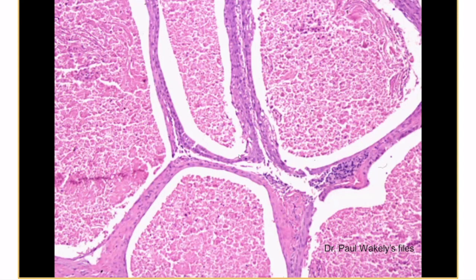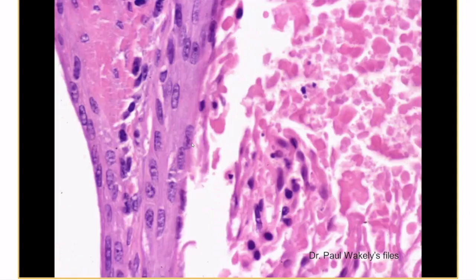And I have the corresponding resection for you. So you see all these trabeculae where you used to see oncocytic cells. Now they are mostly all replaced by squamoid cells. But if you look hard enough here and there, you still find the bilayered oncocytes. And I have a closer view. You see the cells are very uniform, very bland. But on cytology sample, this case can be very challenging, since you can have some squamoid atypia.